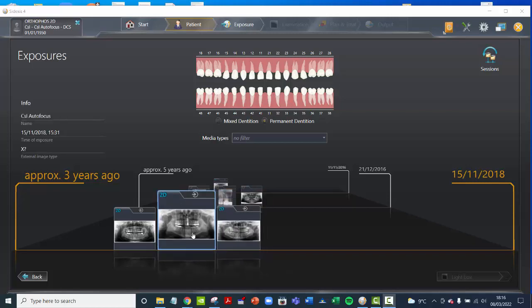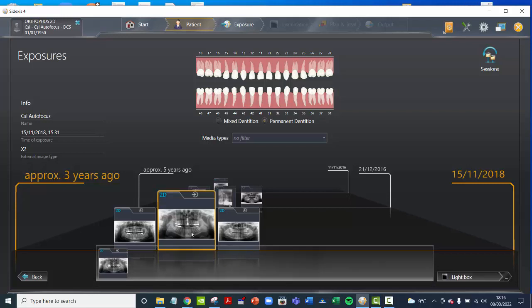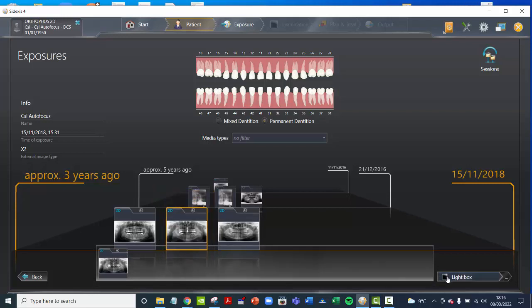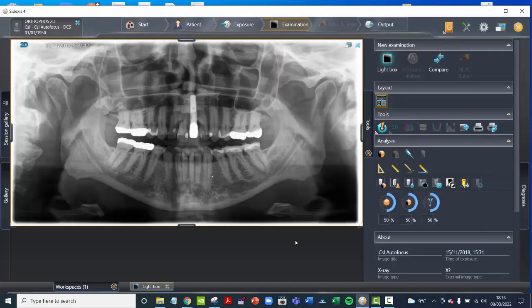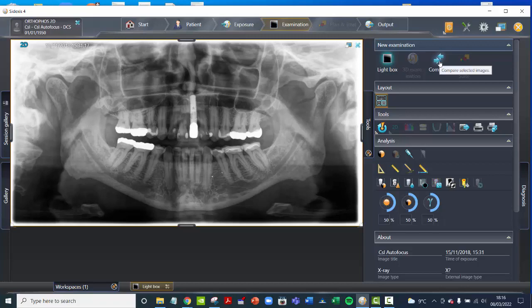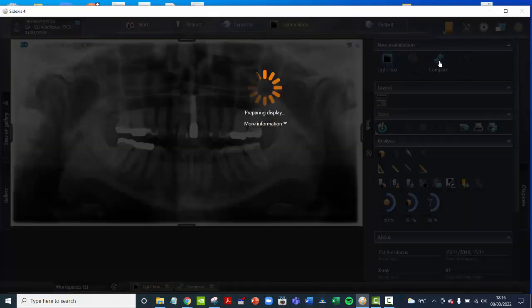The way you do that is find the first OPG that you want, open that, and then when it's open you'll see up here there's a button called Compare. So you click on Compare.